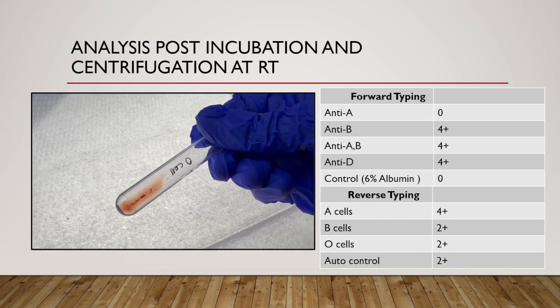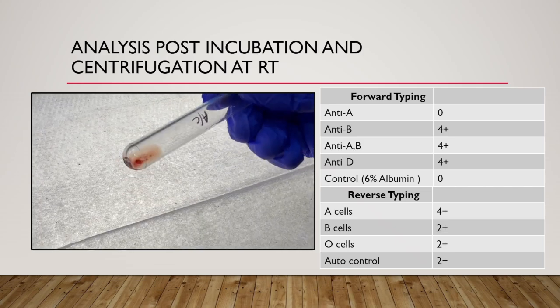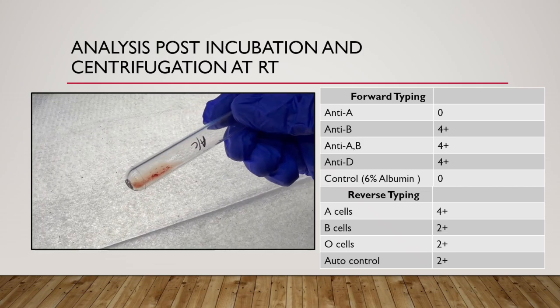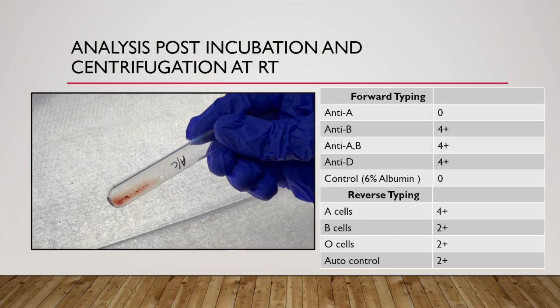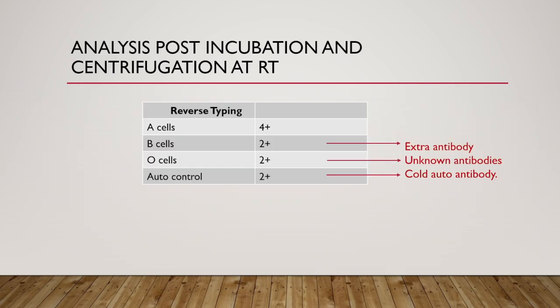Coming to O cell also, we are getting a 2 plus agglutination reaction, and the autocontrol tube is also having a 2 plus agglutination reaction. These are the results we have obtained after reverse grouping at room temperature.